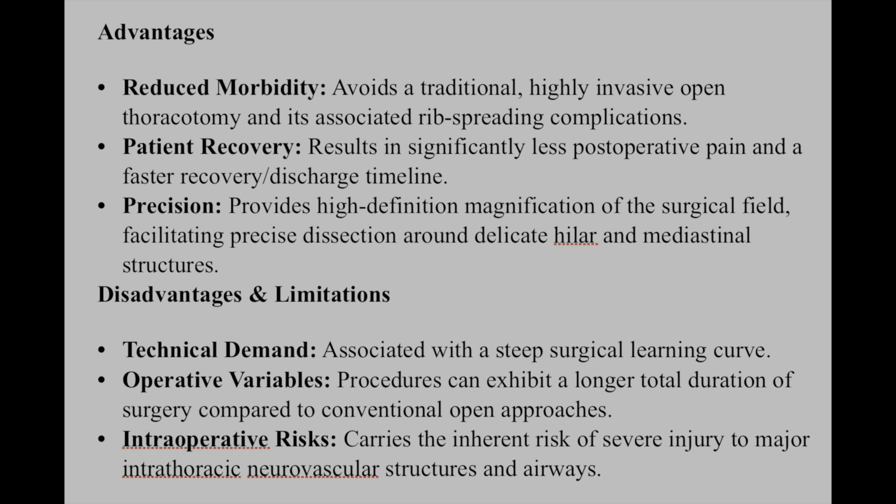Advantages. There is reduced morbidity; it avoids a traditional highly invasive open thoracotomy and its associated complications. Patient recovery: significantly less post-operative pain and a faster recovery and discharge timeline. Precision: high definition magnification of the surgical field facilitates precise dissection around delicate hilar and mediastinal structures.